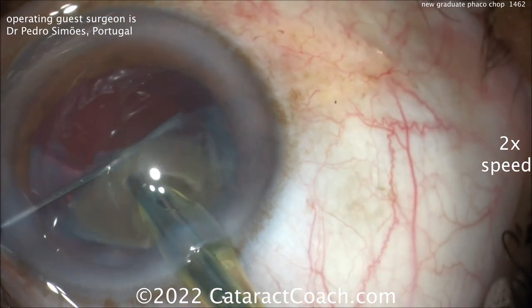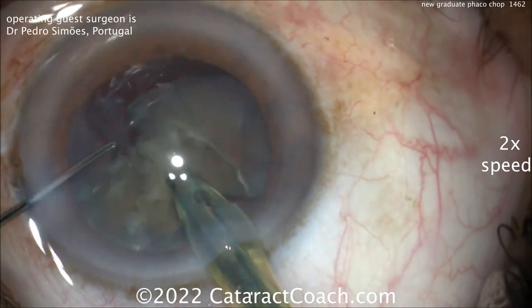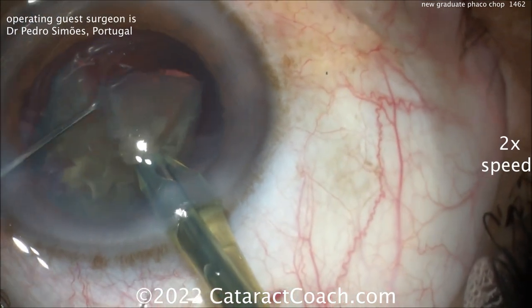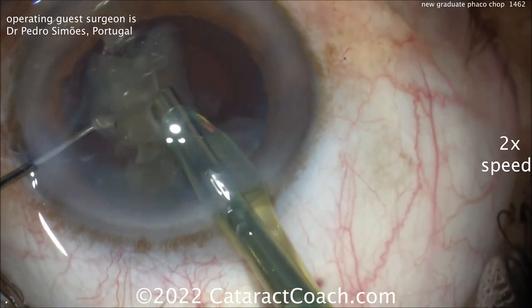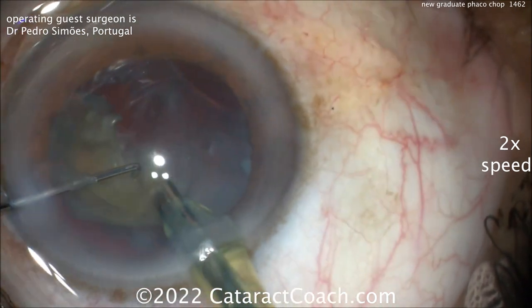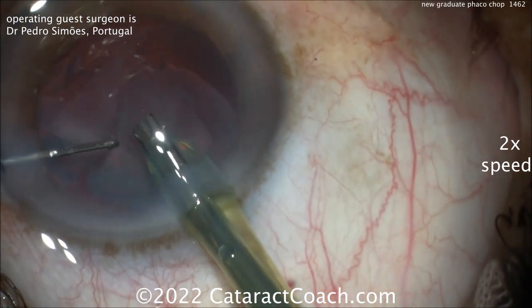You want to get that occlusion — you're using the Faco probe's occlusion to hold the nuclear piece as the chopper helps to split it. What I'd do here is go after that dense piece right in the middle. Once you get that split, you'll get the two halves and it would be a lot more manageable. Going around the equator again — it's a beautiful chop technique. Look at the position of the eye compared to your video screen; it's pushed off to the side. You want to keep the eye in primary the whole case. For your level of training, this is fantastic. You are doing great. I think you'll do even better in the future, and I look forward to seeing your videos a year, two years, or five years from now. I think you'll be an absolutely amazing surgeon.